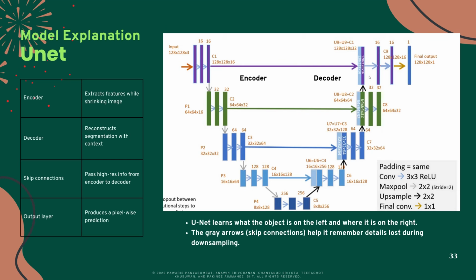But when it goes up the decoder, it is upsampled. When it is upsampled, it aims to rebuild the image from the compressed step from the bottleneck. But when you upsample and rebuild, sometimes you may experience feature loss, because when you go down, the most important feature may not go through. So when you upsample, it may be lost.